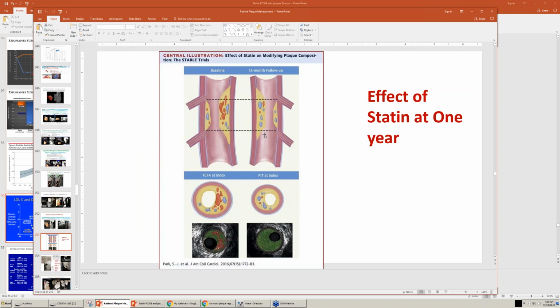And these are the changes that people are observing, where, yes, there is a loss of volume, but look, there's more stenosis. We're seeing more stenosis, loss of volume. Looks like a loss of remodeling on this particular vessel. I can't imagine that, because I don't think that deformation goes in the other direction in terms of remodeling. But these are the pictures that people are showing, and here's a picture that someone is showing. Again, just like the one I showed you, no necrotic core, more stenosis, and basically a more stable plaque. That's going to result in warning and angina rather than a sudden cardiac event.